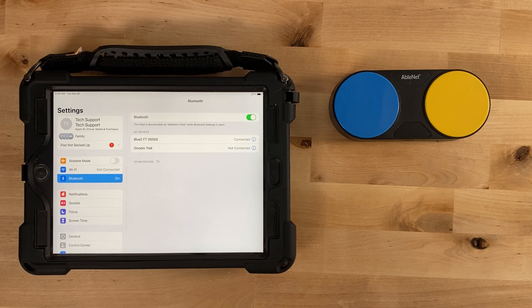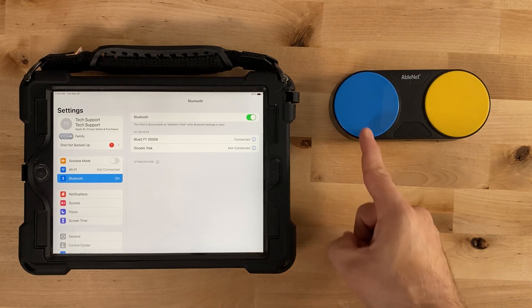Both keyboard commands can be changed. After 20 minutes of non-use, Bluetooth will go to sleep. To wake up, touch either switch top.